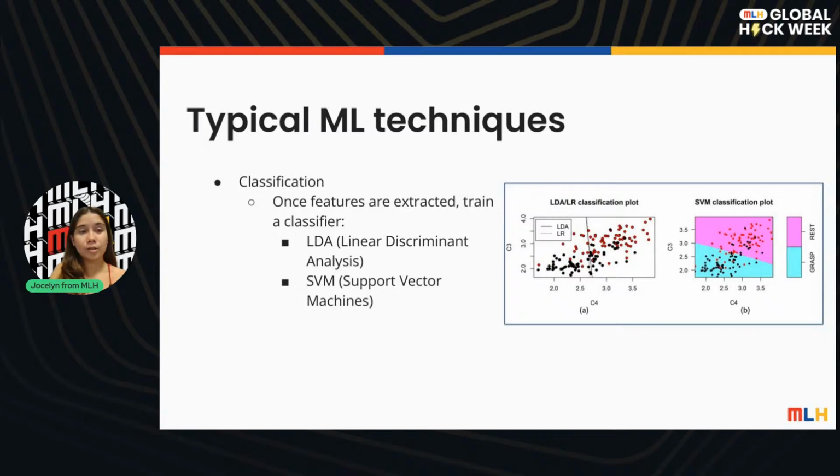So if you know about machine learning and you want to get into data analysis for EEG signals, then this is the correct spot, because you will be able to understand these algorithms and play around with the data. At the end, it's just like classifying images of pets or classifying text, or whatever pattern you want to analyze using machine learning. For EEG signals, it works the same, because you need to identify specific events happening in your brain, so you can then associate those events with something you want to produce on your external device.